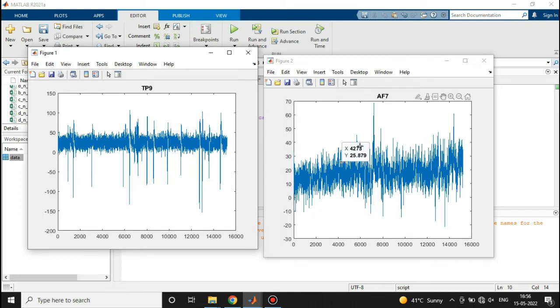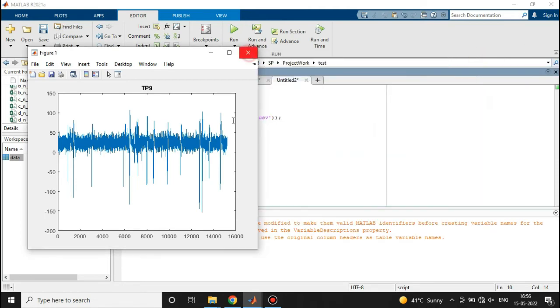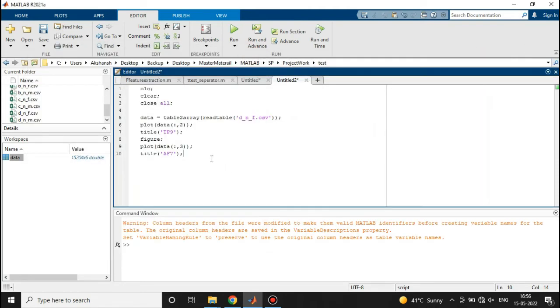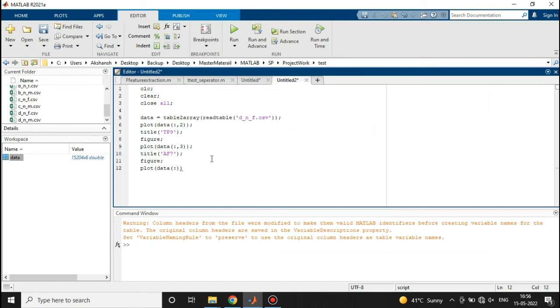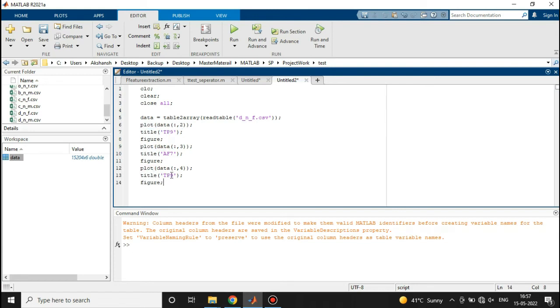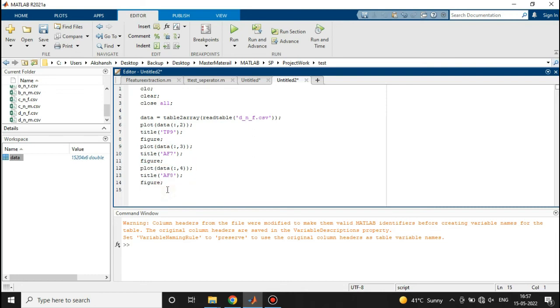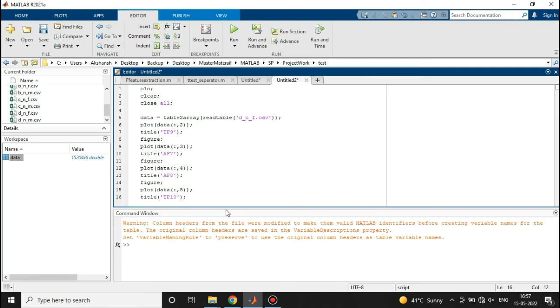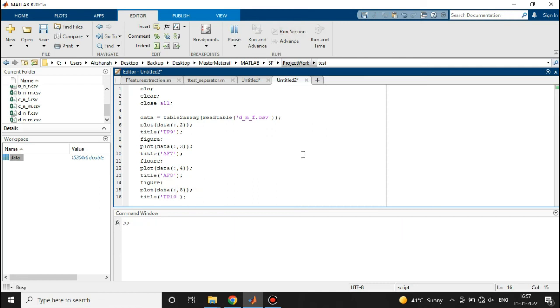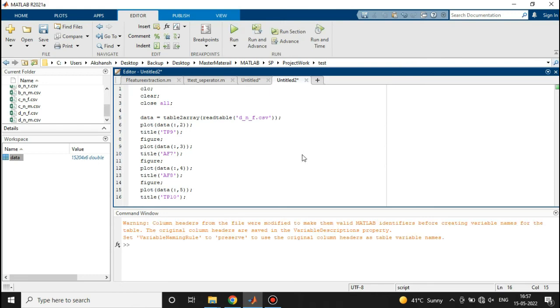We can plot the rest of the two columns also. Plot data column 4, then we have figure and title also. Just copy paste here. The next one was AF8, and for the fourth one, the fifth column, we had TP10. Let's run the program again. Now we have four different figures.